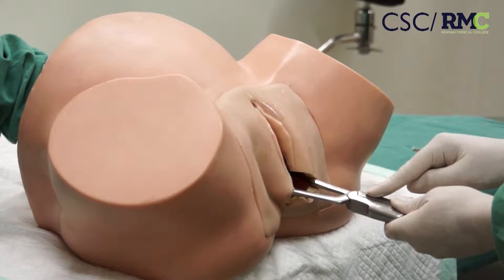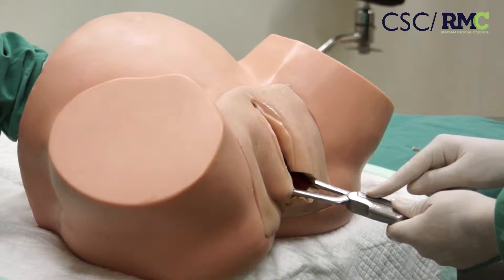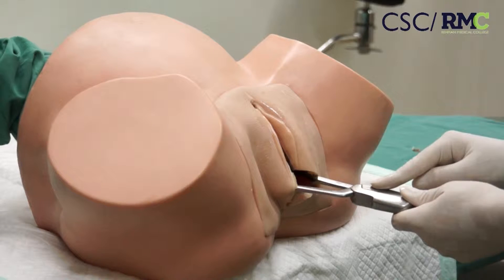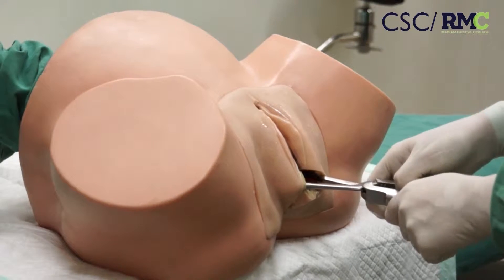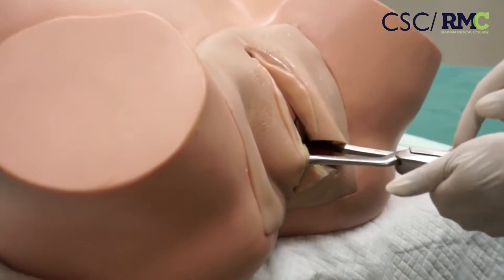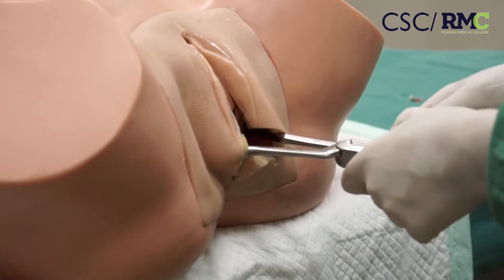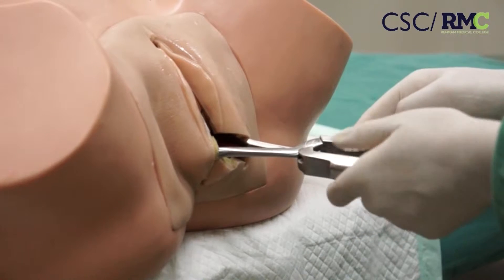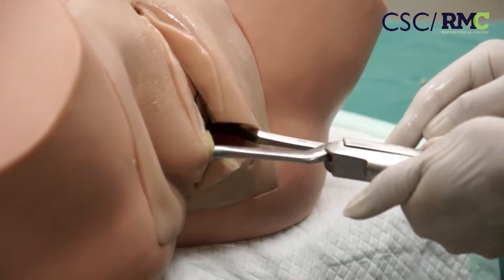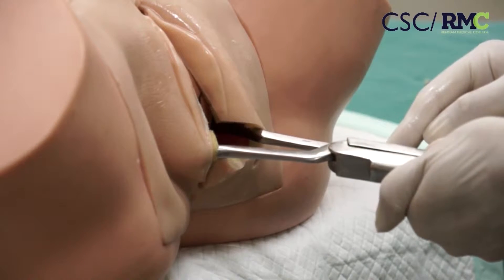Immediate and easy locking means that the position has been correctly assessed. If they don't lock, do not apply pressure to make them lock. Inability to lock easily means the position has been incorrectly assessed, so reassess the position.